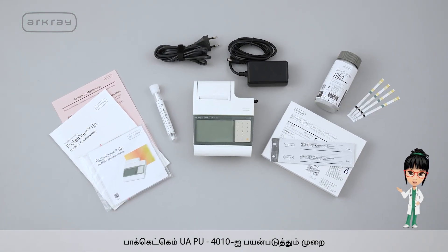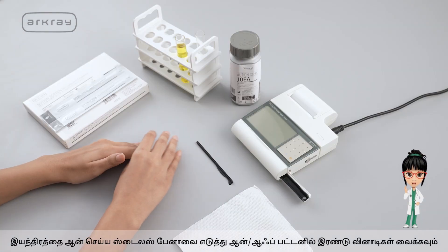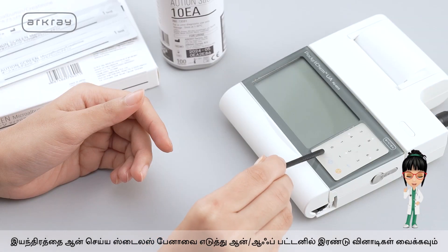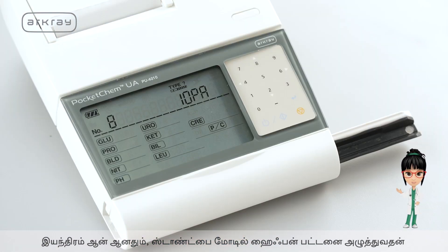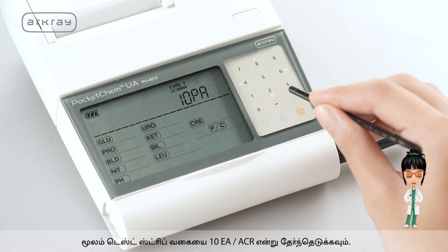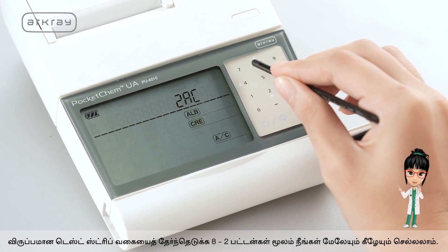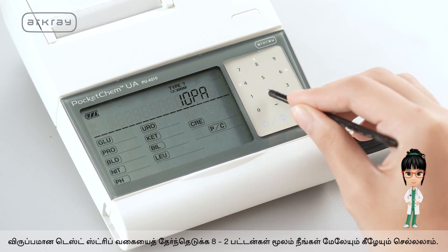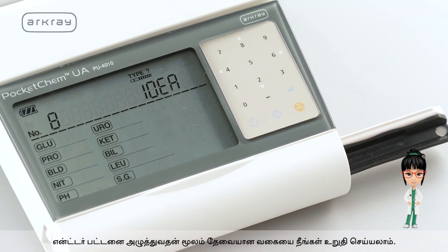Here's how to use Pocket Chem UAPU4010. Take the stylus pen and hold the on/off button for 2 seconds to switch on the machine. When the machine is switched on, select the test strip type to 10 EA or ACR by pressing the hyphen button on standby mode. Through the 8 and 2 buttons, you can go up and down to select the preferable test strip type. Confirm the required type by pressing the enter button.